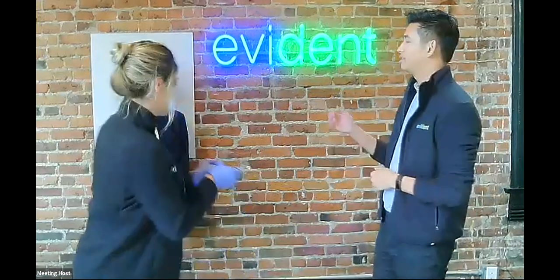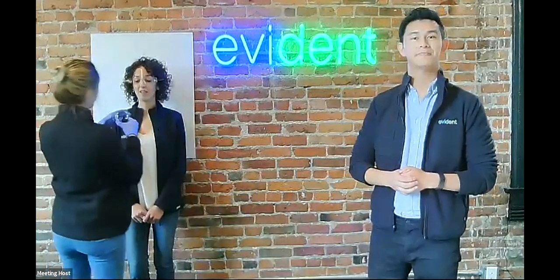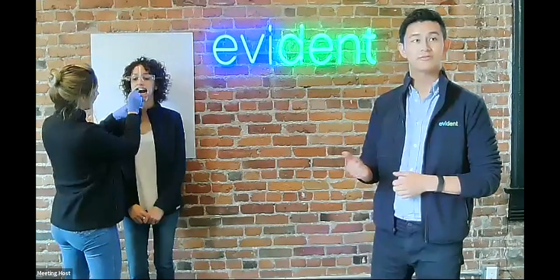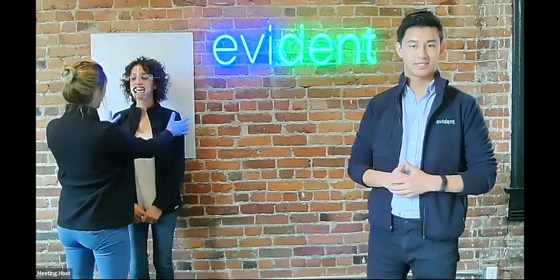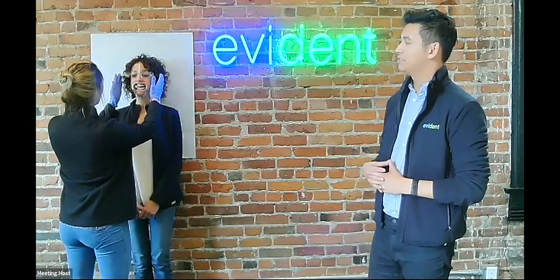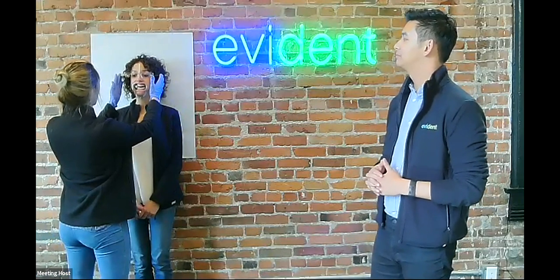So next, I'm going to invite my colleague, Dr. Nikki Dos Ramos, and she's going to grab a retractor, and she's going to help the patient insert it into their mouth. And then she's going to take a cotton roll and she's going to place it in the back of their mouth. And the patient will lightly bite down. And then realign the glasses if need be.